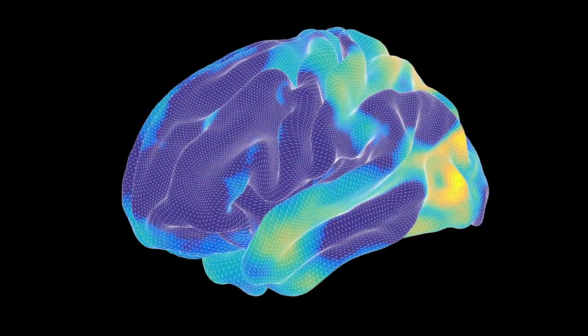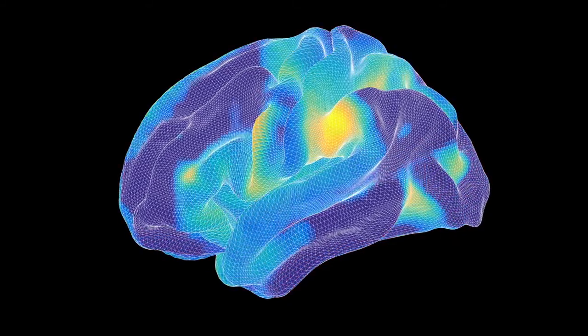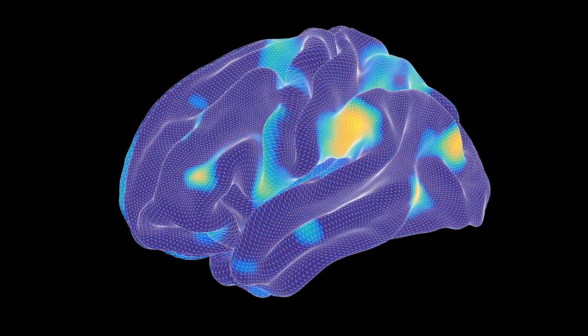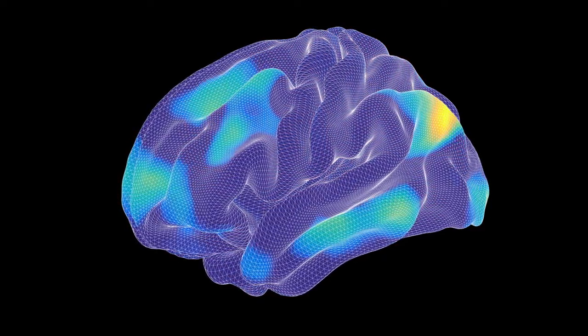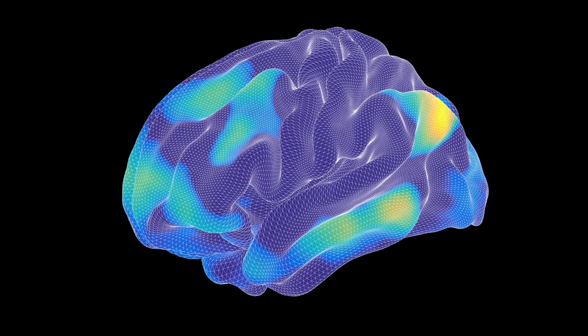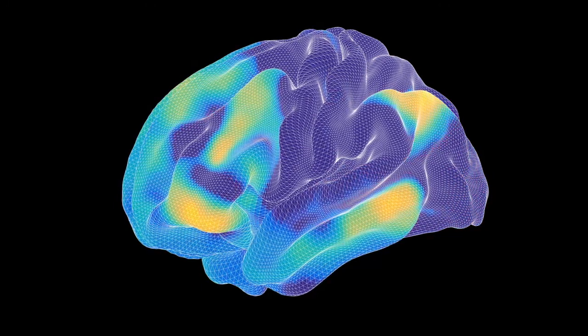Here we see the interaction of 15 independent components, each a distinct brain network. This is the brain of one individual, simply resting in the scanner with her eyes open. The video plays in real time, inviting us to think along with the scannee, following the waves of activity sweeping among the folds of her cortex.